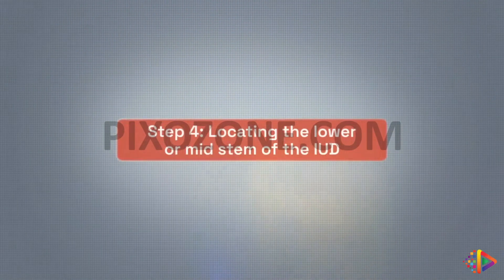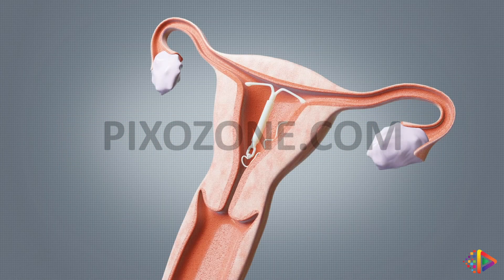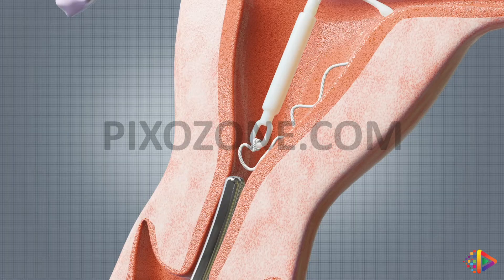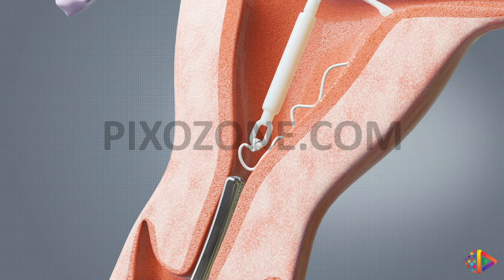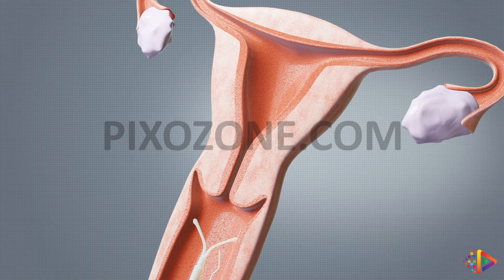Step 4: Locating the lower or mid-stem of the IUD. If you're unable to grasp the IUD as described in Step 3, advance the IUD remover into the uterine cavity and repeat the search. A tenaculum might need to be applied to the cervix to straighten the utero-cervical angle, which would facilitate advancing the IUD remover into the uterine cavity. Open and close the jaws and gently pull back to see if you've successfully grasped the device.